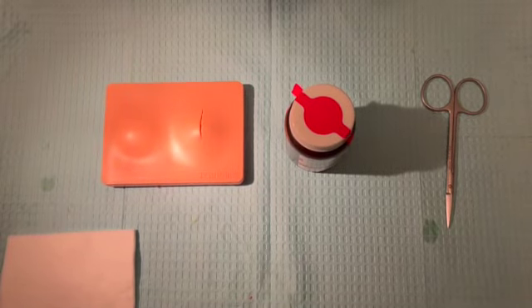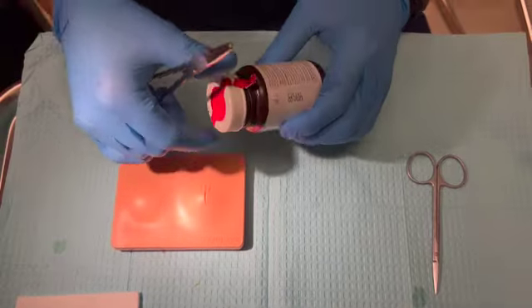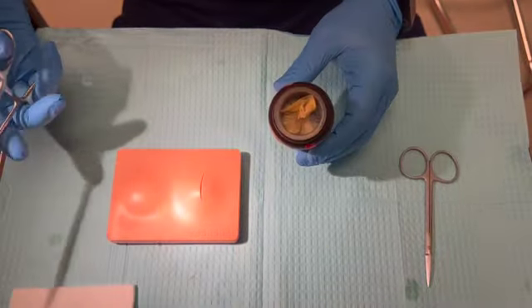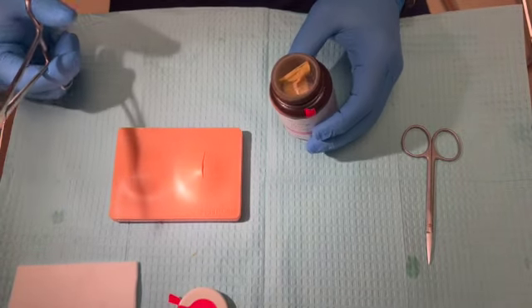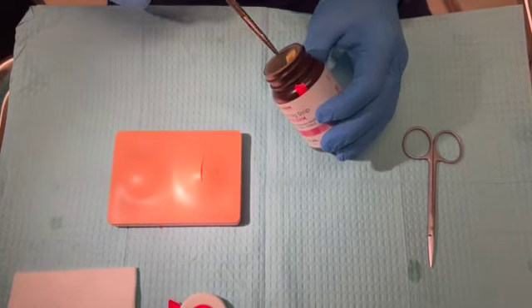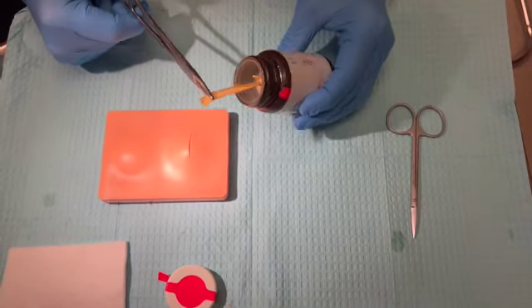have another abscess produce. So in order to place packing, we want to be careful not to touch the packing material at this point with our gloves. Again, trying to reduce introducing any further infection to this area. This is iodoform packing. Iodoform is an antiseptic and can also help against further infection.